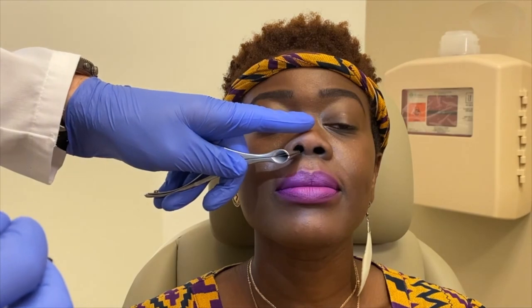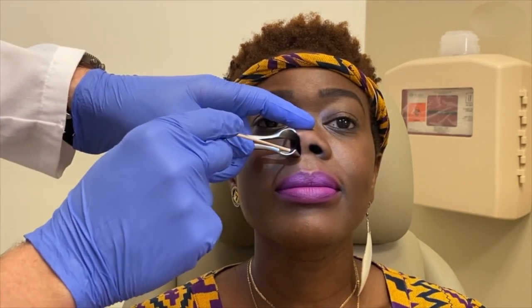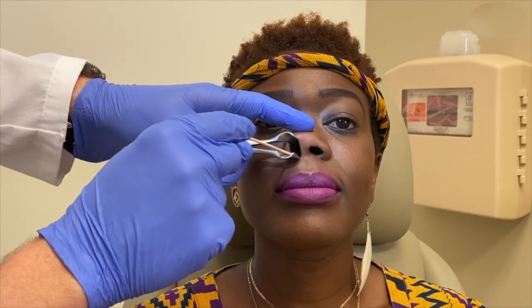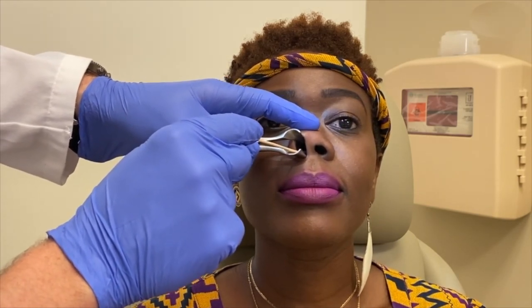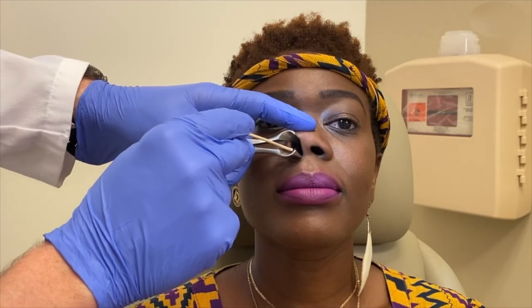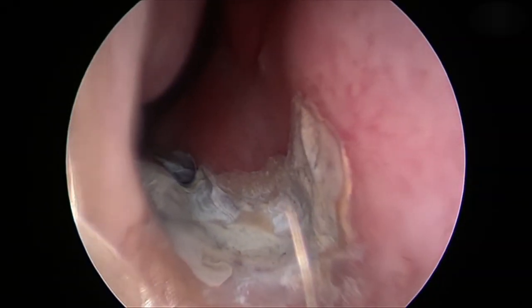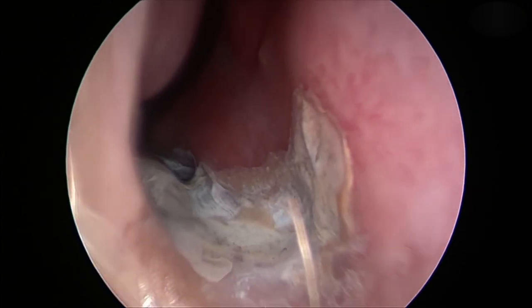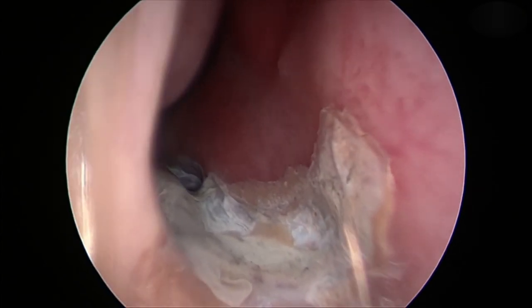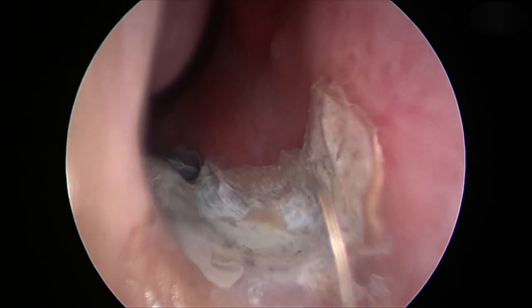In adequate lighting conditions, apply the silver nitrate to the mucosa around the prominent vasculature. For large vessels, it may help to apply the silver nitrate circumferentially around the vessel to limit its blood supply before targeting the vessel itself. When performing cauterization in Kiesselbach's plexus, address the entire course of the vessel, including its proximal component along the floor of the anterior nasal cavity.